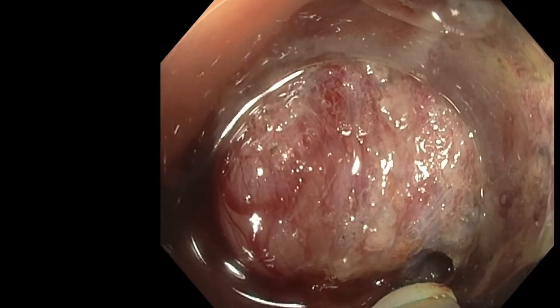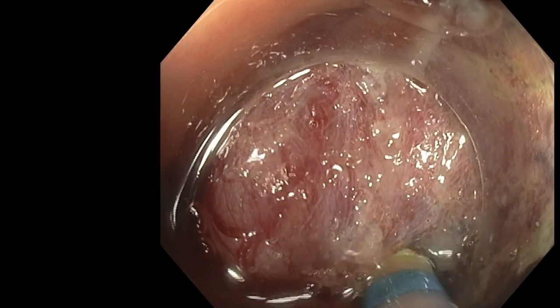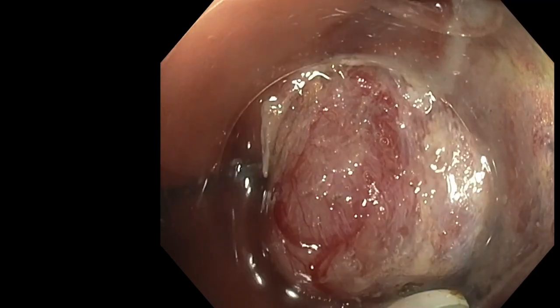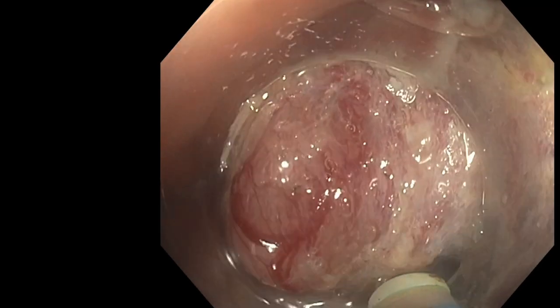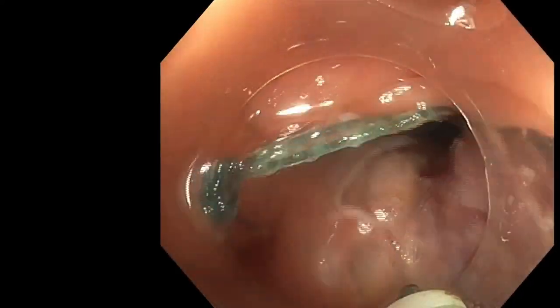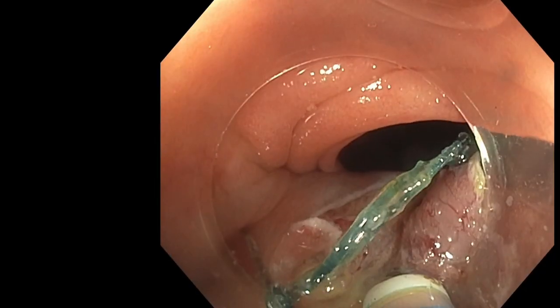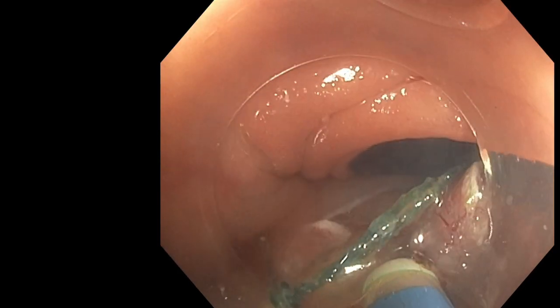Patience is needed for this kind of case because it's quite difficult to cut in only one way and to go fast in the same direction. You should spend time to remove all the fixation and all the submucosal fibers all around the diverticula in order to open the space. So what is needed now is to turn around, I said it before, because it will concentrate the traction only on the deepest part in the diverticula.